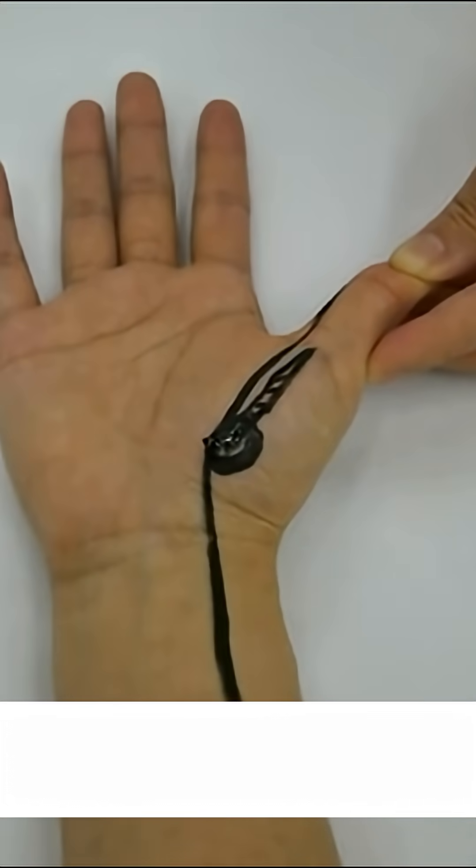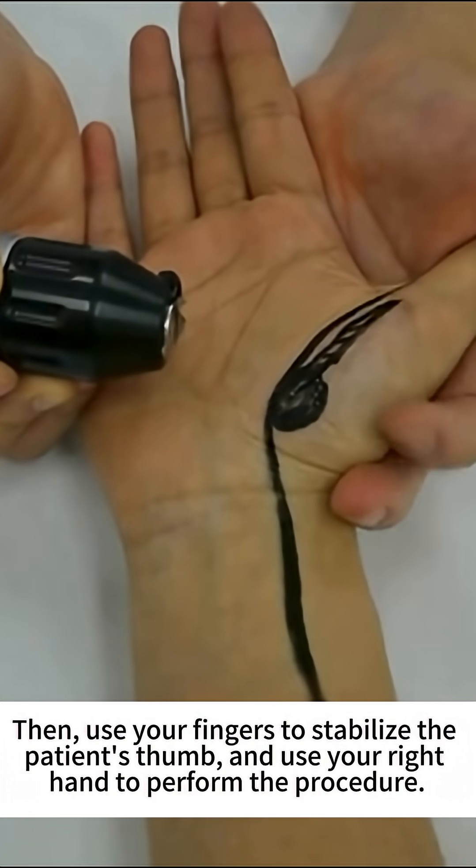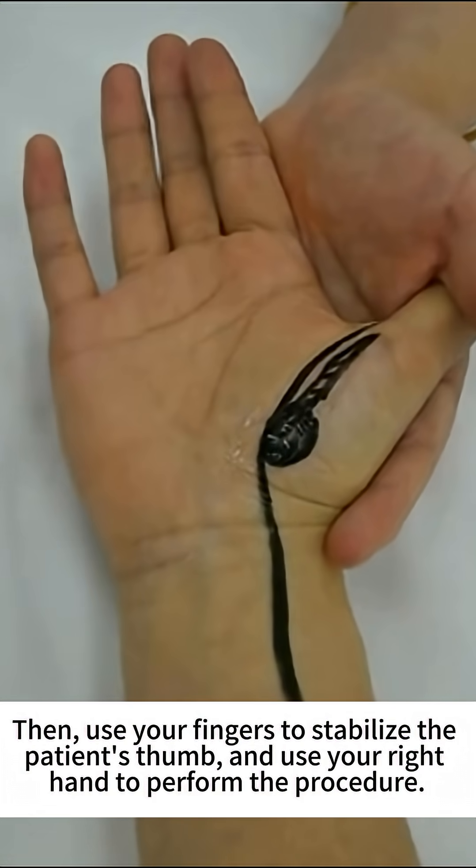First, apply coupling gel. Then use your fingers to stabilize the patient's thumb and use your right hand to perform the procedure.